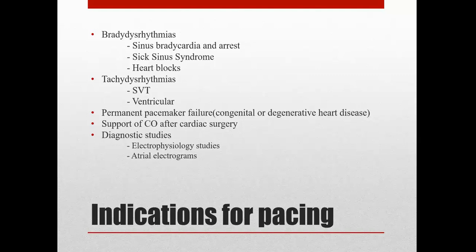Honestly, the most people that I have personally ever had to pace have been third-degree heart blocks. They come in, their heart rate's in the 20s, 30s-ish or so, and it's like, oh yeah, you're definitely in a third-degree heart block, and you look at their EKG, and it's like, okie dokie, we need a pacer. A lot of the time, unless the patient is just completely unstable, we will temporarily pace them in the ICU overnight, and then typically they'll go down the next morning and get an actual pacemaker put in, and then everything's fine. They go to the floor and go on about their merry way.